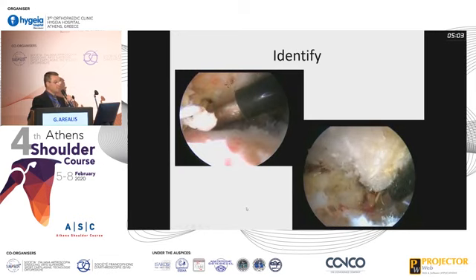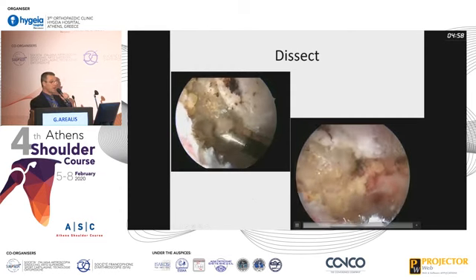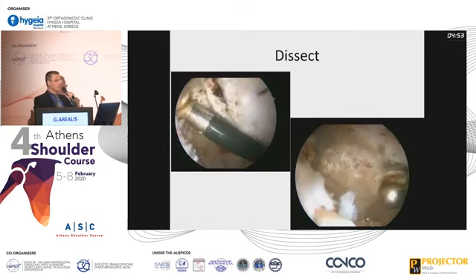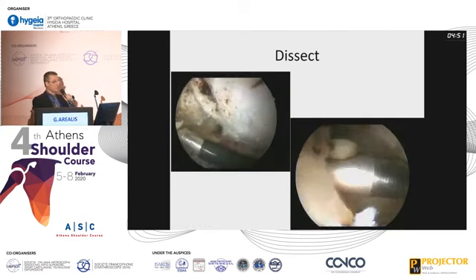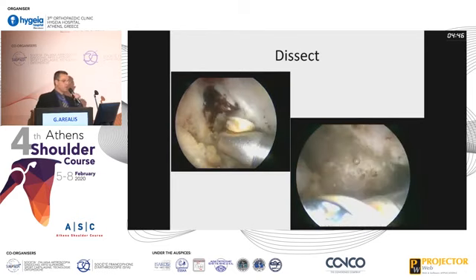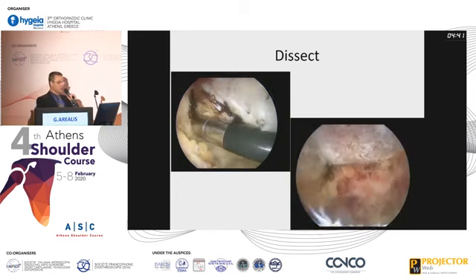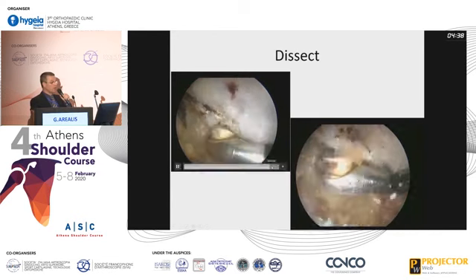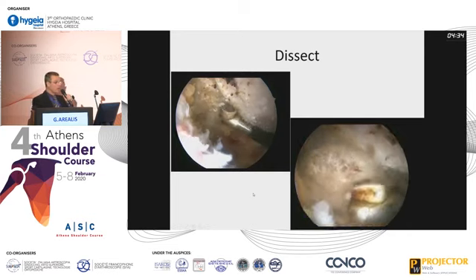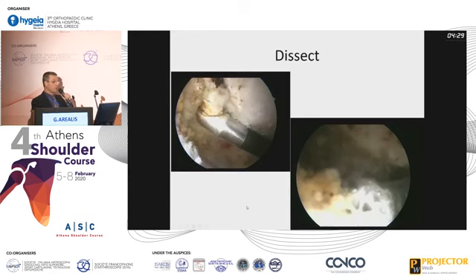then the next step is to dissect your AC joint. You need to dissect it from the lateral and then from the anterior portal. I don't do a second portal. If I've already worked inside the joint from anteriorly, then I use the same portal. I just shift the skin a little bit higher and enter the joint from the front. Otherwise, you just put a needle and you go in from anterior like you would do an anterior portal. And you dissect your AC joint, avoiding the posterior and superior capsule. All you're allowed to do is take the anterior and inferior capsule, and then you're safe not to create instability.